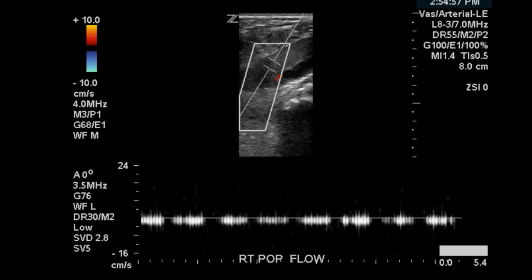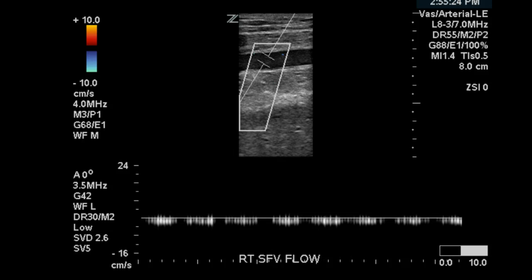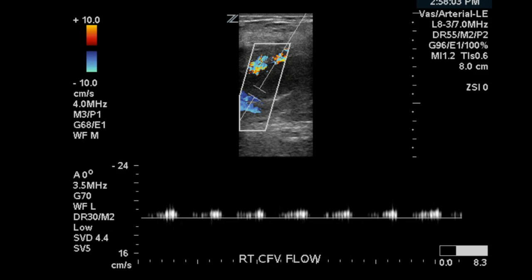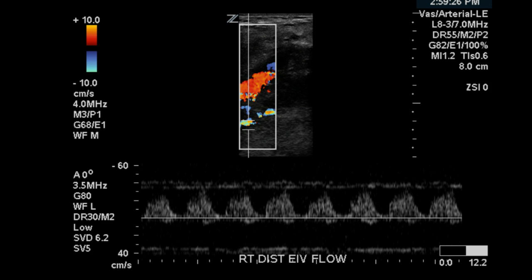Of course, pulsatile flow is not normal for the veins. The same is found in the femoral vein, the common femoral vein, and the distal external iliac vein — all representing pulsatile venous flow.